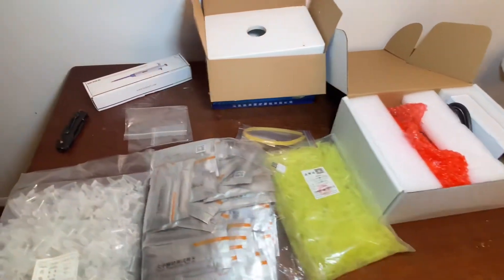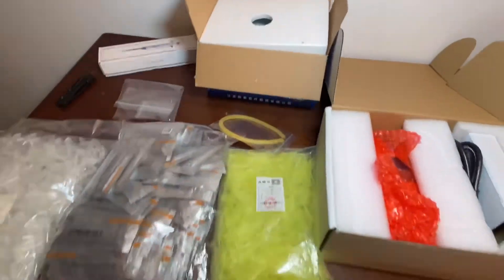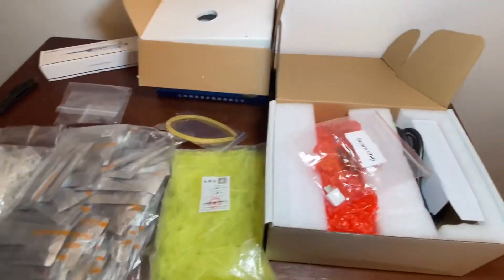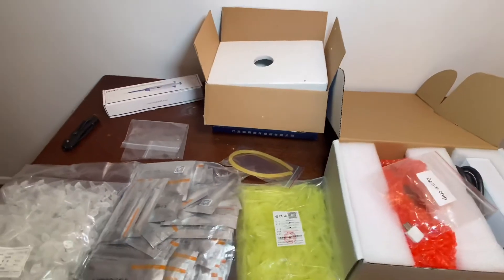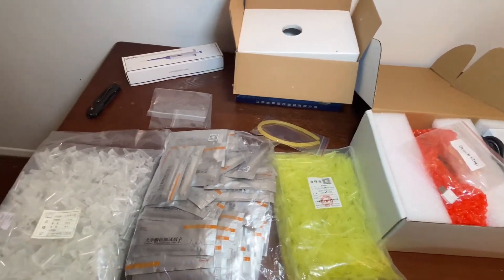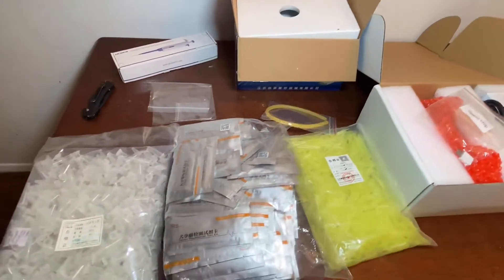I ordered this machine directly from the company, no third party. I see a lot of people are not getting everything they're supposed to get in the kit when they order it — like spare chips. This machine has a one-year warranty and comes with all the instructions.